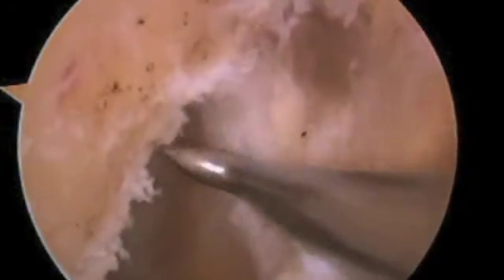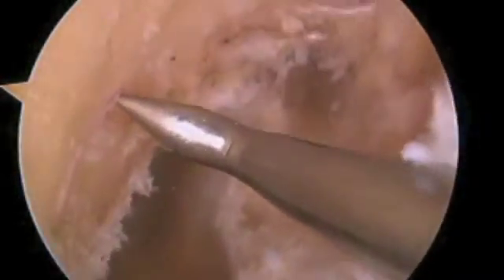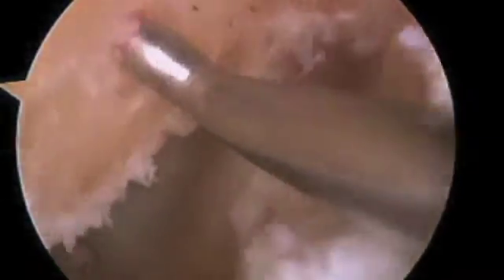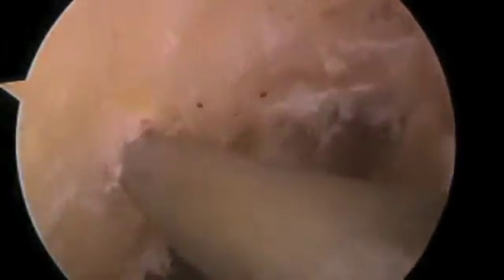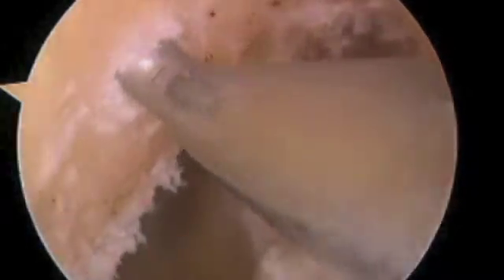You want to be in the anatomic position, which is right about 9:30 to 10 o'clock on the dial. This little red spot on the femur is pretty clearly right about where you want to start. My starting point is typically right behind residence ridge. I may do the drilling a little bit differently, which I'm going to show, which will allow us to clearly place this tunnel where it should be.